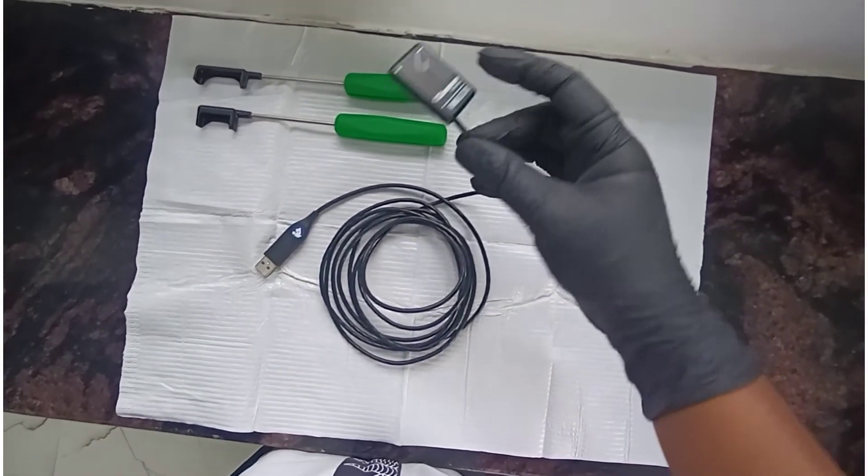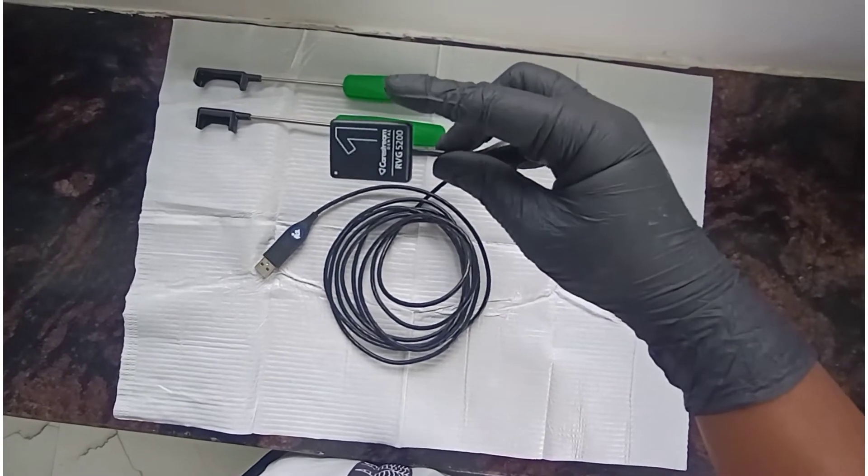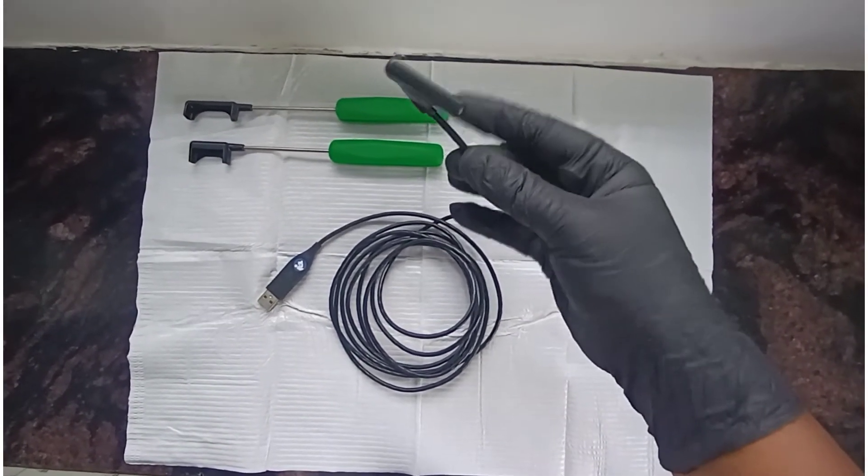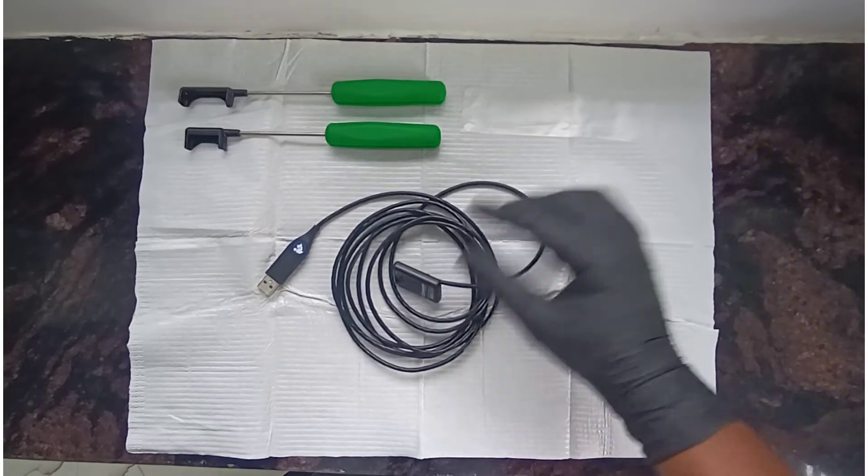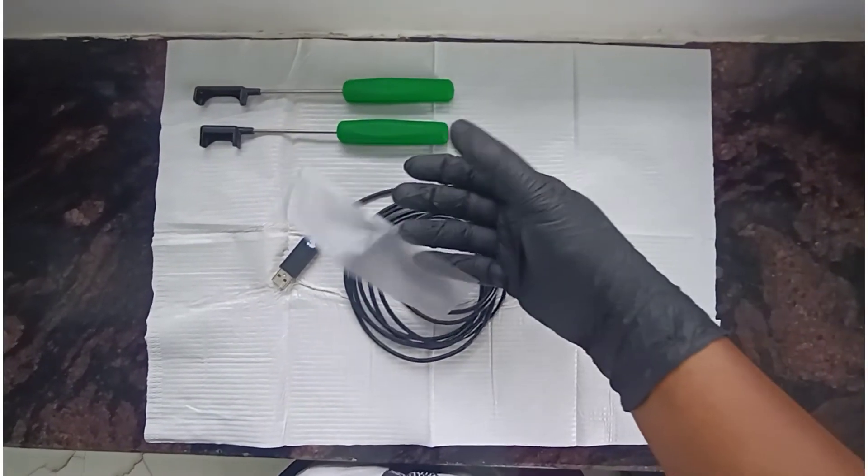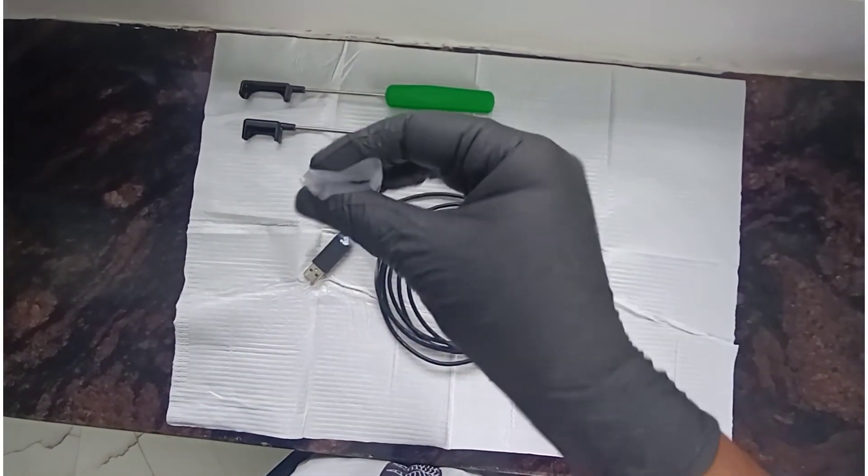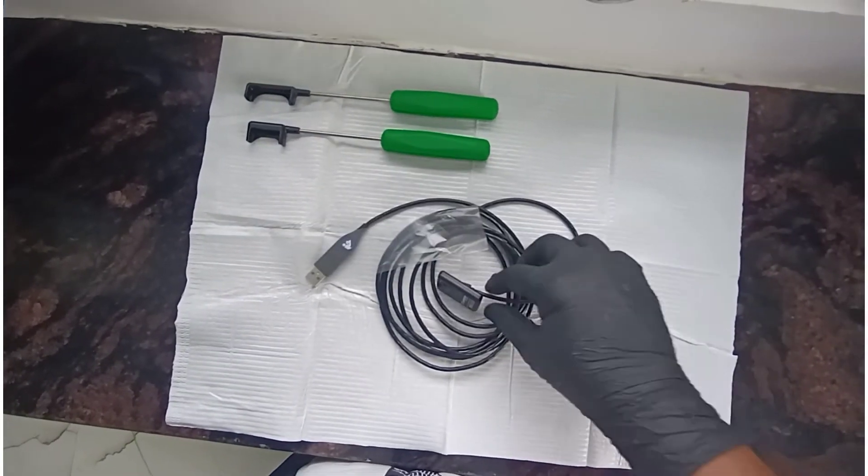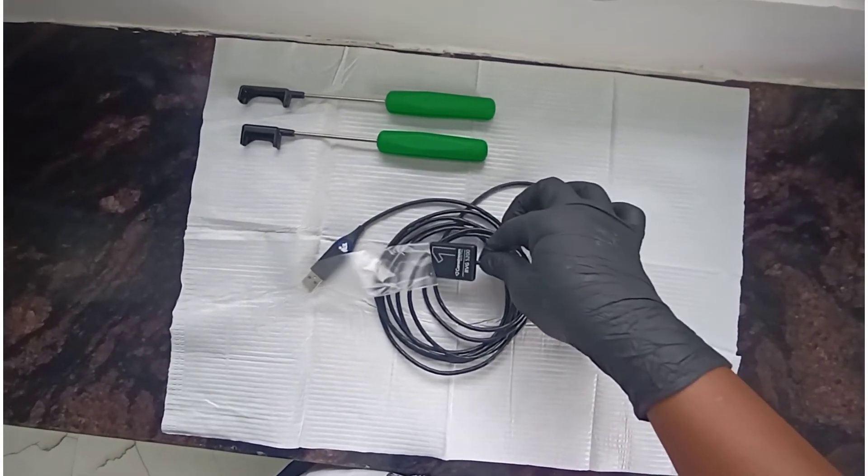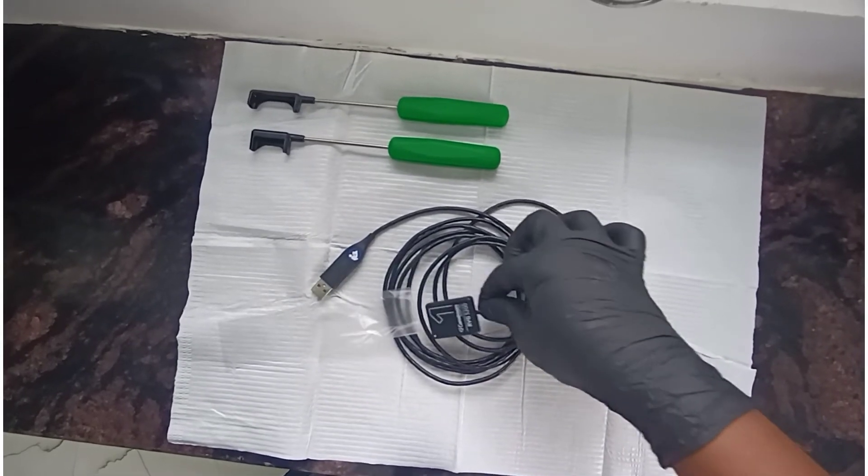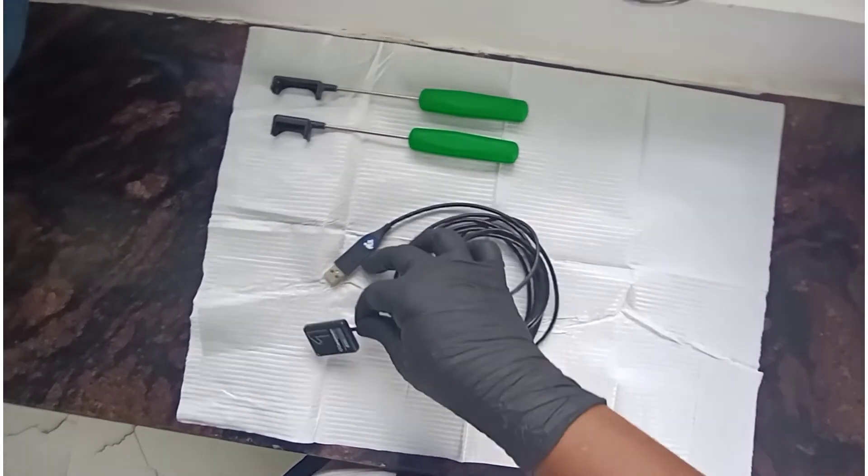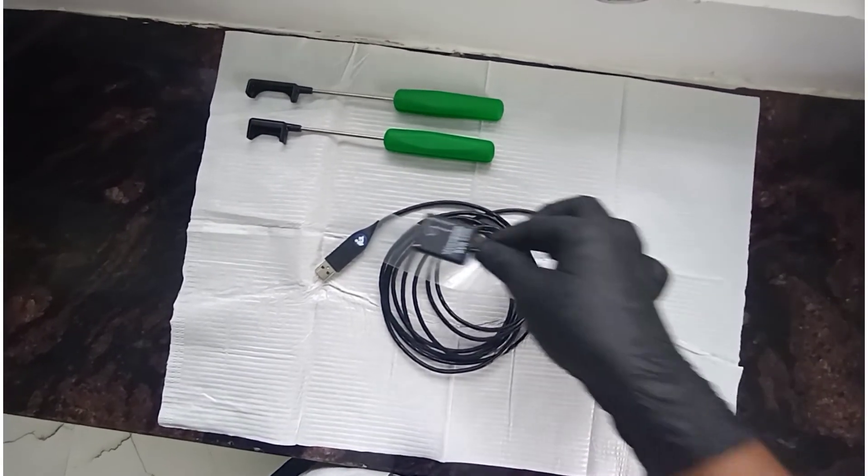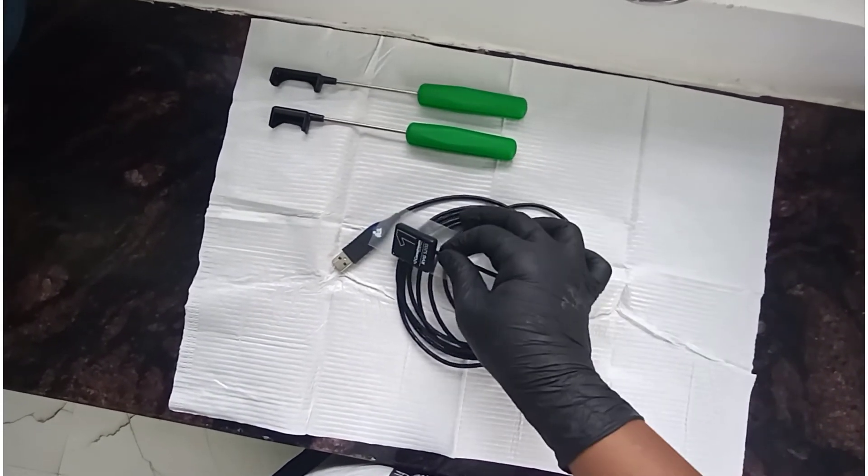Along with these, this is an RVG sleeve. It is disposable. For every patient, you have to put the sleeve to protect the sensor from getting wet, and it's good for sanitization.